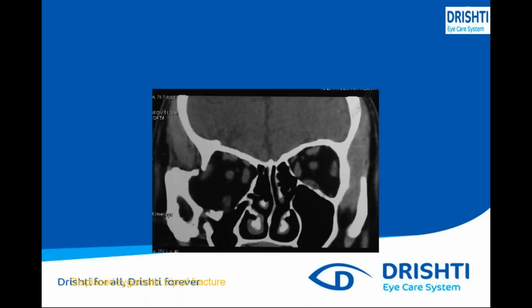Now the other picture. This is the other eye. If you see, this is the regular bony area, and you can see there is a fracture here. This is an RTA accident case, so there are multiple fractures. In this way, the bony area has to be identified. All the enhanced areas are the bony, hard surfaces. If there is any discontinuity between the two surfaces, you need to think that this is a fracture in the bone.